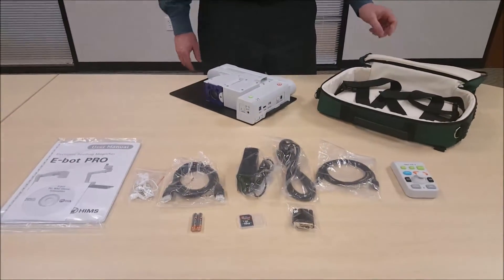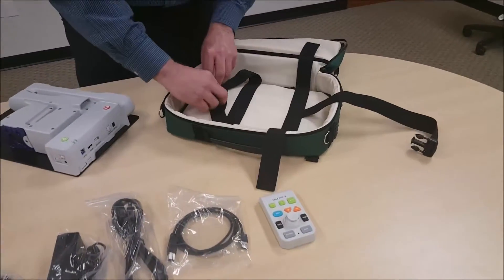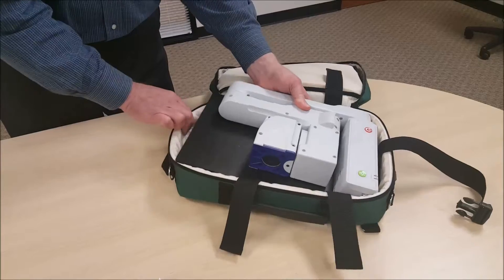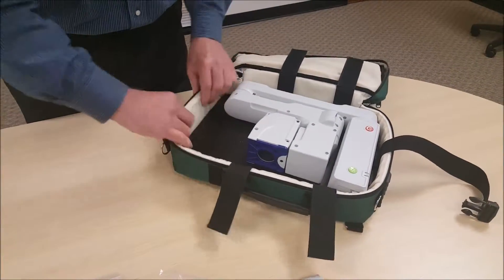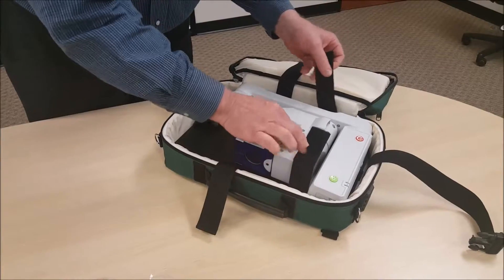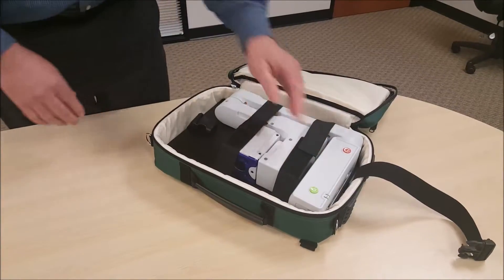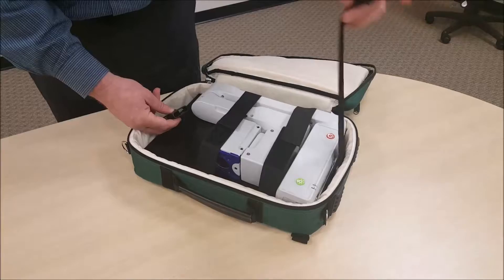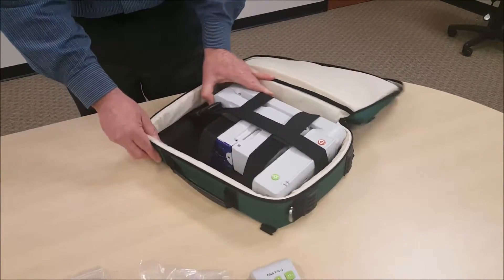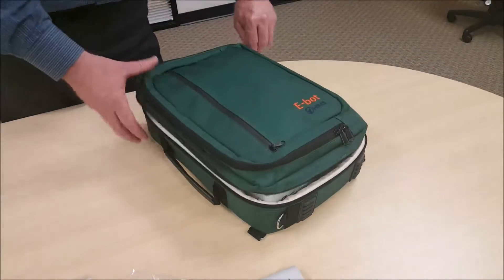To put it away into the backpack, open up the main compartment and undo the straps that will secure the E-Bot once it's placed inside. Put the side straps on — they're just velcro so they're easily fastened down. The last strap that goes vertically on the unit snaps into place, giving you a very secure E-Bot that won't get damaged during transport. Then zip that up.